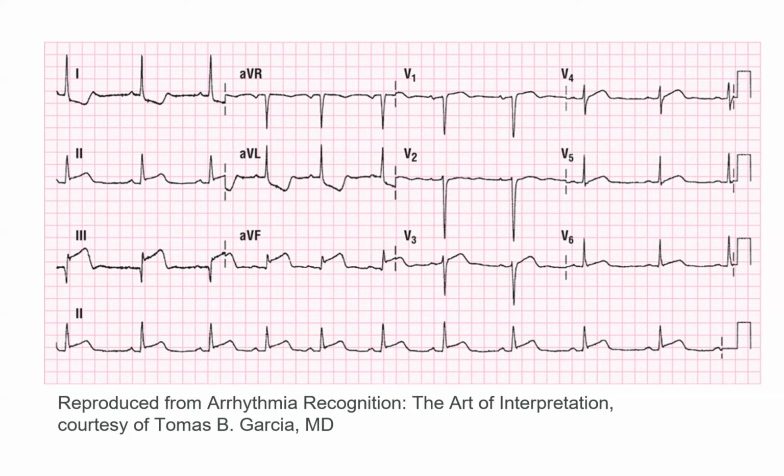If they're nowhere near your threshold, I'm still going to get a right side 12 lead, but I'm not going to be so hesitant. If they're at 160 or 110, I'm not even concerned. I want them to come down that 40 points. That's fine. So if they drop 40 points on one spray, you don't think I'm going to do a second, do you? No. If we're at 110 over 60, and they're right side involved, do you think I'm going to do one? No, because I don't want to deal with 70 over 30. Is everybody tracking? It's super important everybody's tracking.